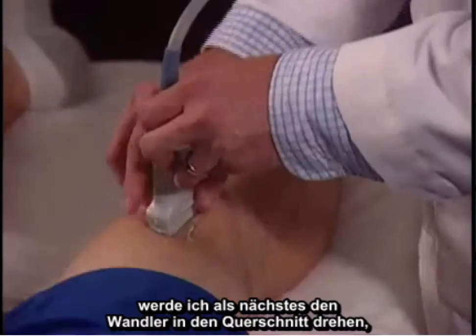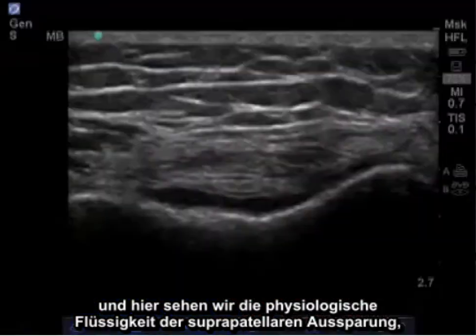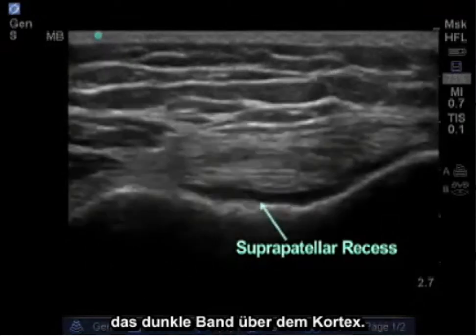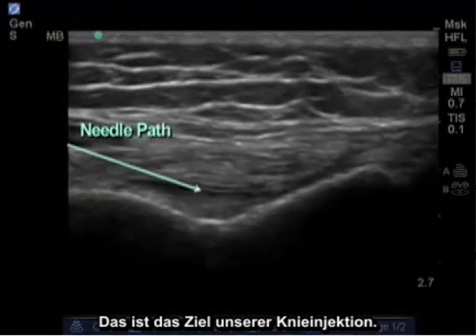Next, in setup for the injection, I'm going to rotate my transducer to cross-section. Here we can visualize the physiologic fluid of the suprapatellar recess, which is the band of darkness above the cortex. This will be the target site of our knee injection.